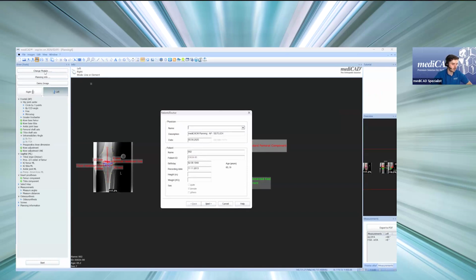the French customer base. So I will quickly cover this, since this is obviously not interesting for everybody, but we already were happy to announce our partnership with, I hope I can pronounce that correctly, RENA.COT, which is a prosthesis register in French. So every case you can plan here can be exported into this registrar with your implant information that you use for your plan. It will automatically be exported with your PACS upload, and then will be uploaded into the registrar.